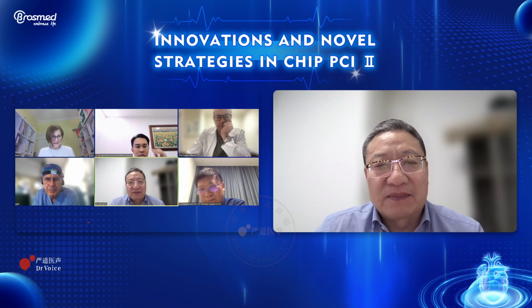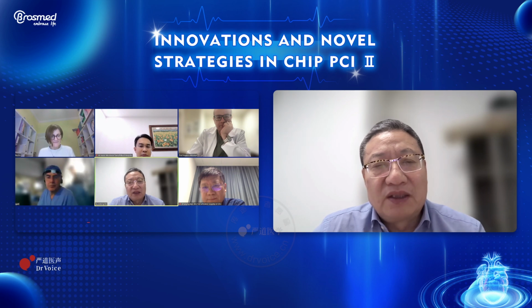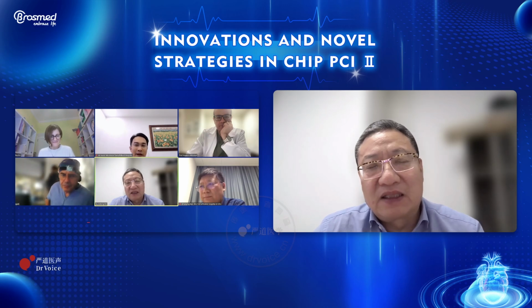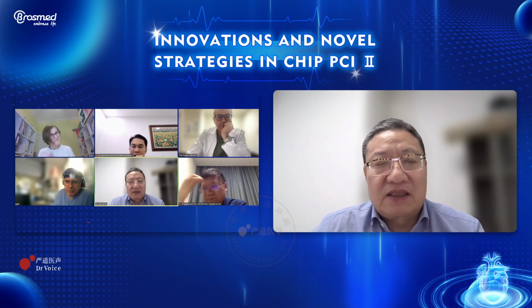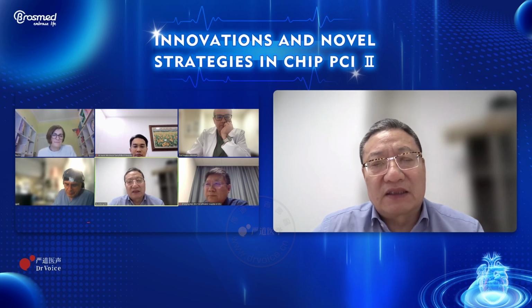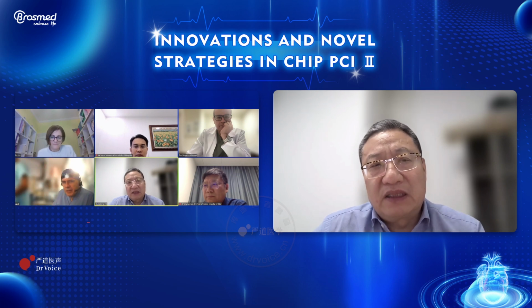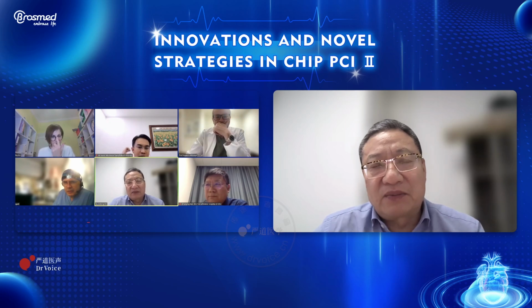First is post CTO and stent to the ostium, and also the guiding catheter is very, very difficult to engage. And the second is post TAVR and CABG, and also the ostial vein graft stenosis. I think for the second case, I have a little bit of comments, since we talked a lot about CABG being much better.